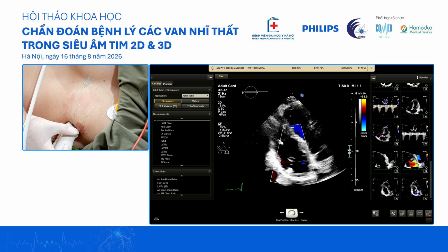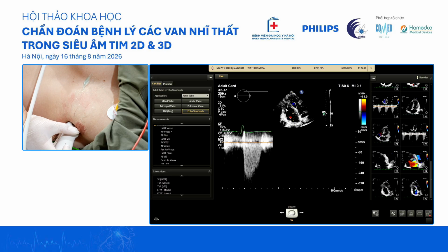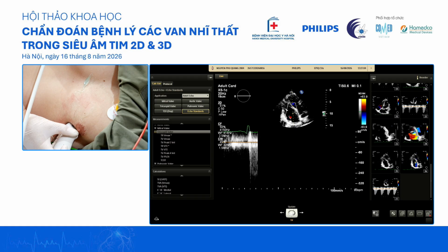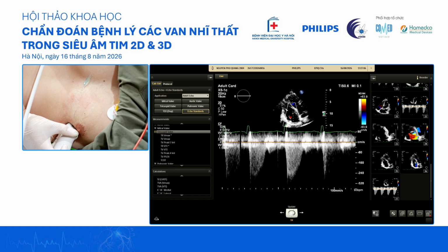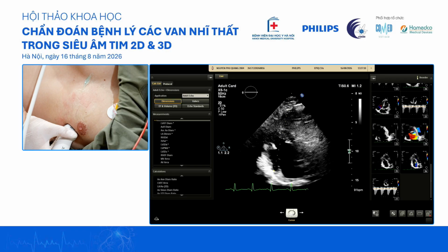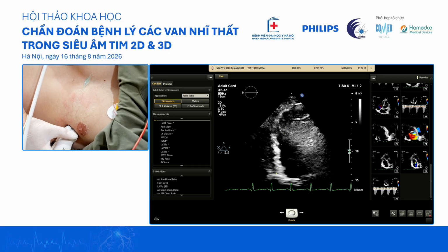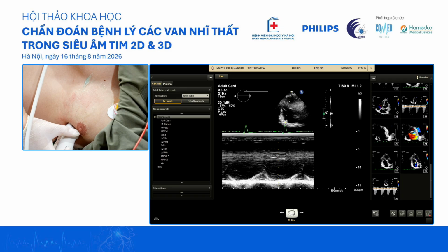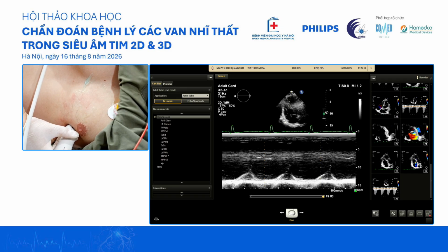So at every different plane and angle, we will interrogate the tricuspid regurgitation. We want to get the highest velocity in order to calculate your pressures. Chúng ta cũng đo chênh áp vận tốc tối đa qua van ba lá ở mặt cắt này. Vận tốc tối đa sẽ được dùng để tính áp lực động mạch phổi tâm thu.